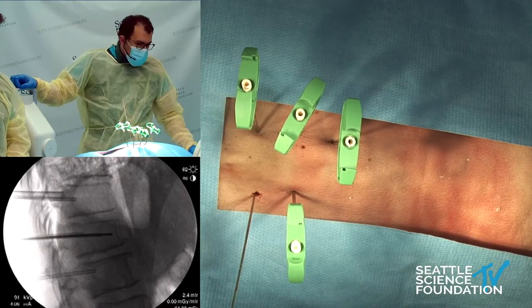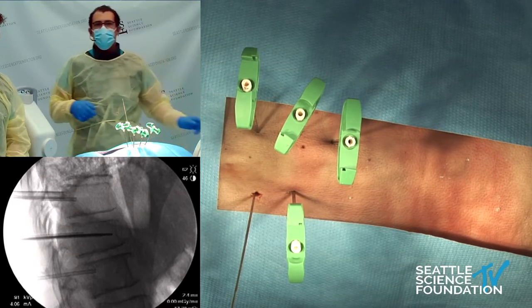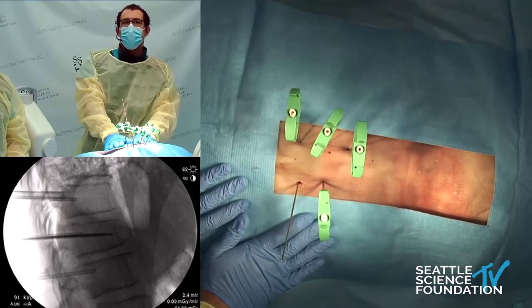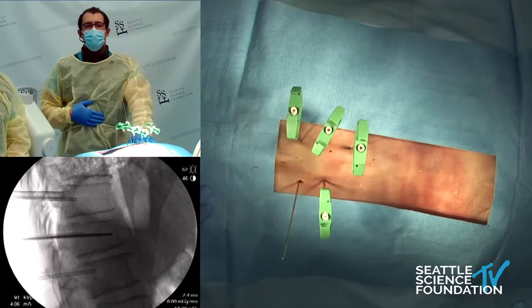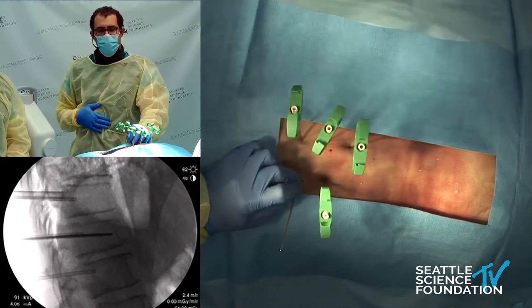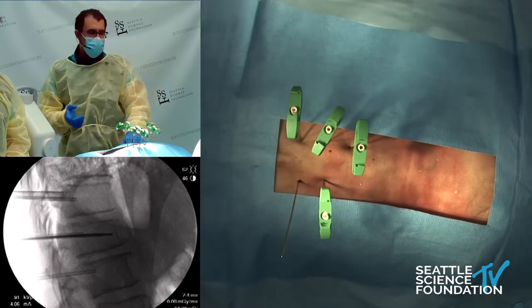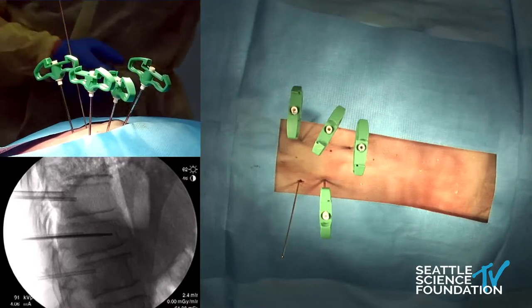We are going to start up at the top here. You can see over on the camera, we've put in some of our Jamshidi needles ahead of time, very similar to MIS technique. We're going to start with our spine jack on the top here — we have a guide wire — and we will grab the cannula.